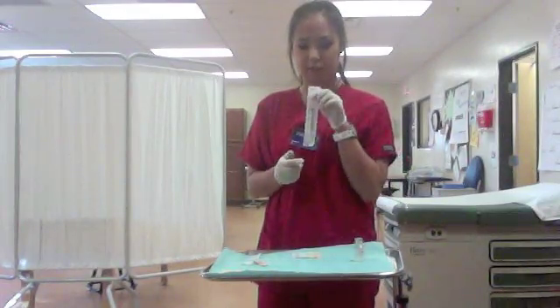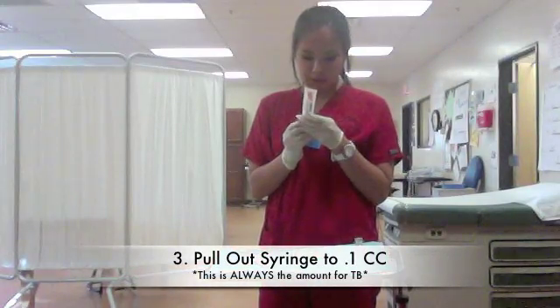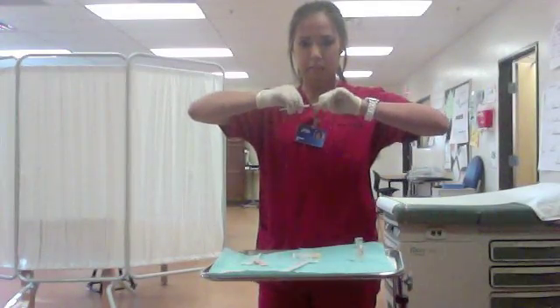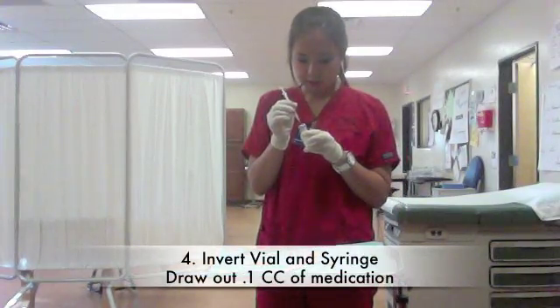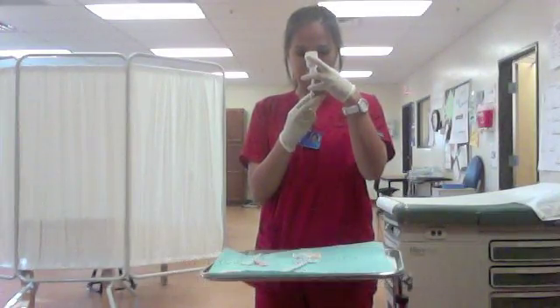The next thing you do is grab your 1cc syringe and draw it up to 0.1. Take it out, make sure the cap is on tightly, then you open it and inject it into the vial. Push the air in, and then draw it up to 0.1.